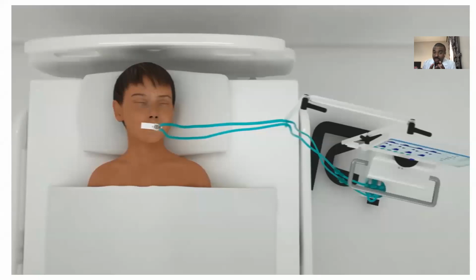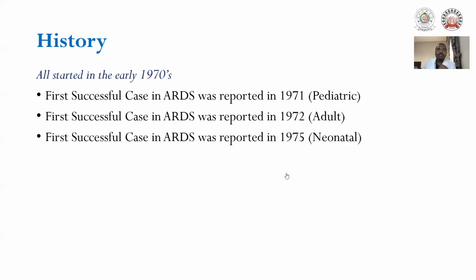ECMO is resource intensive. Remember that it is a highly resource intensive, highly specialized and expensive form of life support, with the potential of significant complications, in particular hemorrhage and nosocomial infections.